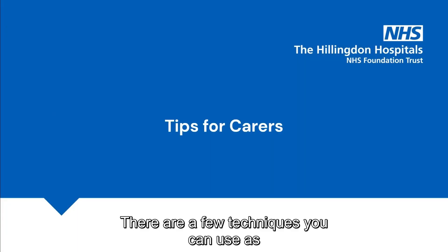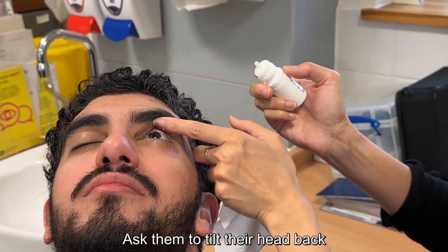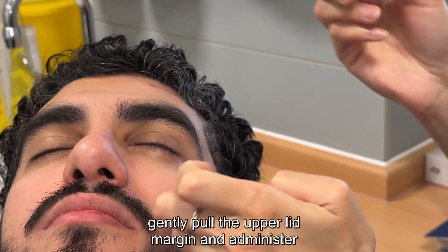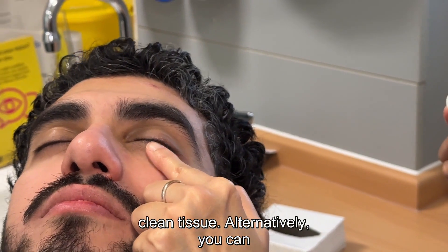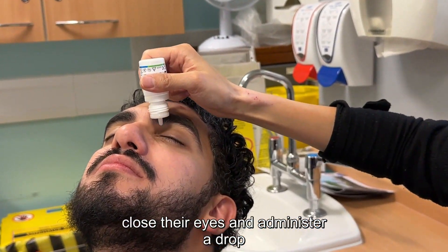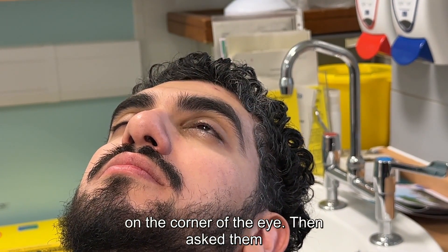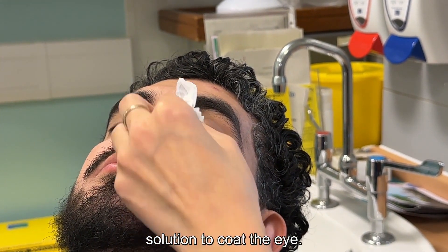There are a few techniques you can use as a carer for patients requiring eye drops. Ask them to tilt their head back, then gently pull the upper lid margin and administer the drop. Blot any excess liquid with a clean tissue. Alternatively, you can pull the lower lid. Another option is to ask the patient to close their eyes and administer a drop on the corner of the eye, then ask them to open and close their eyes to allow the solution to coat the eye.